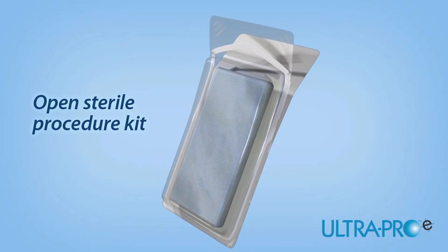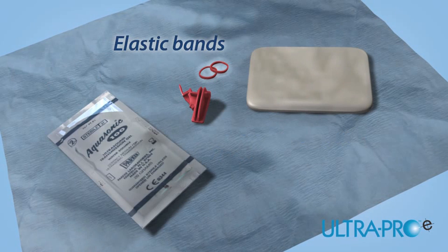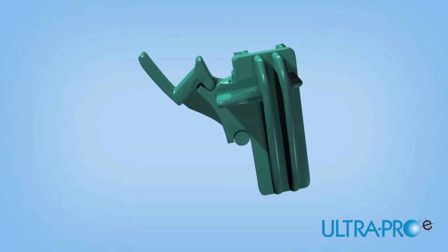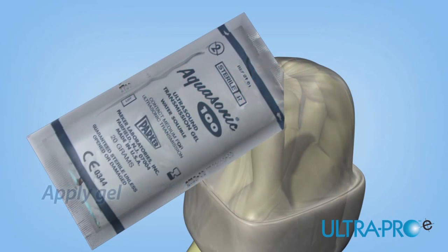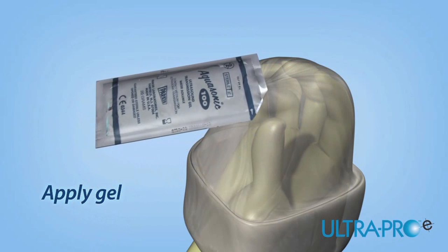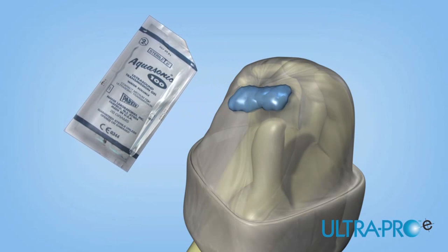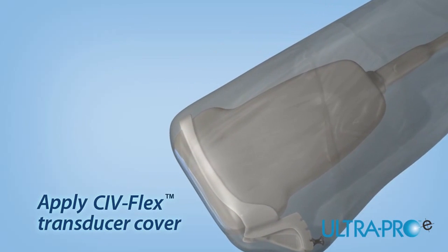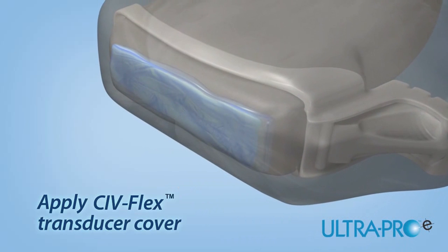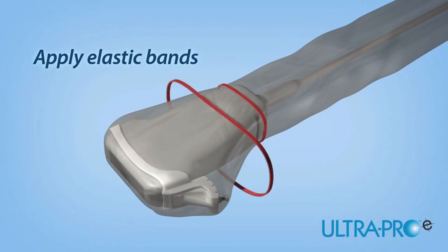Using proper sterile technique, open the UltraPro E needle guide procedure kit. Inside, you will find an UltraPro E needle guide, CivFlex transducer cover, gel packet, and colored elastic bands. The UltraPro E is a single-piece, color-coded needle guide available in 14, 16, 18, and 20 gauge kits. Open the sterile gel packet and apply gel to the inside of the CivFlex transducer cover or directly onto the array of the transducer. Apply enough gel to entirely cover the face of the transducer. Place the gelled CivFlex cover over the array of the transducer and extend the cover over the length of the cord, ensuring sterile technique. Carefully remove any air bubbles between the transducer face and the cover. Apply the enclosed sterile elastic bands to secure the cover in place.